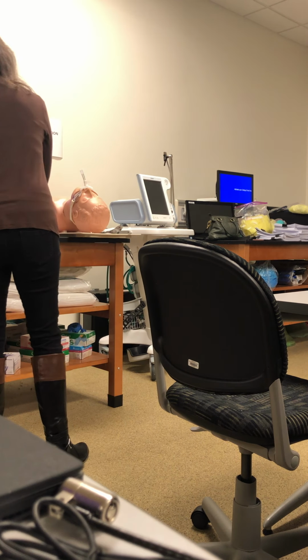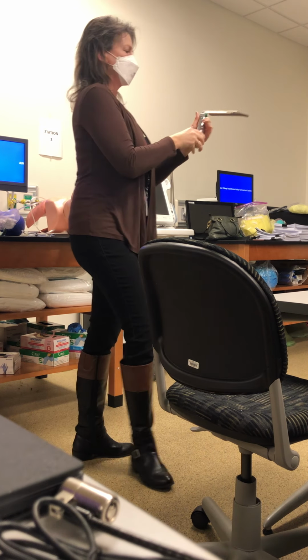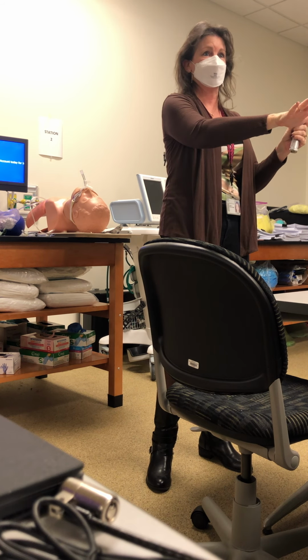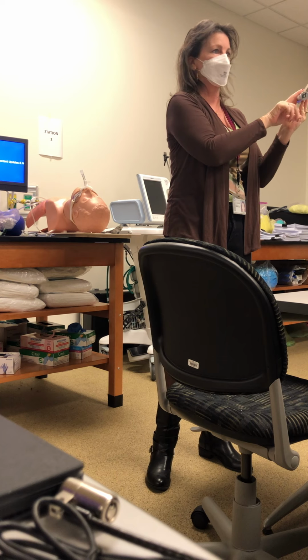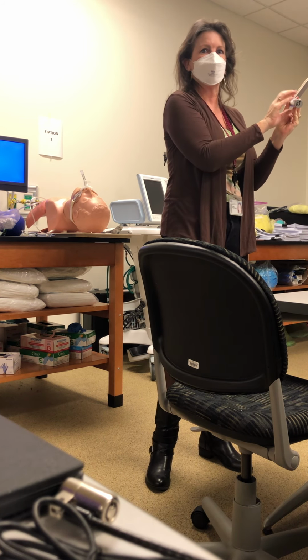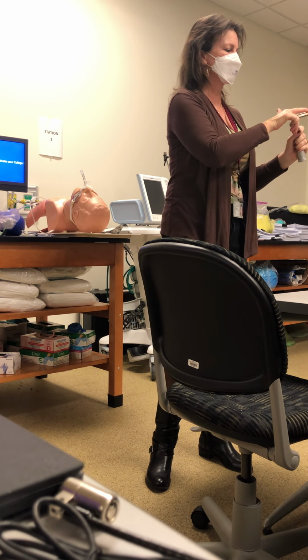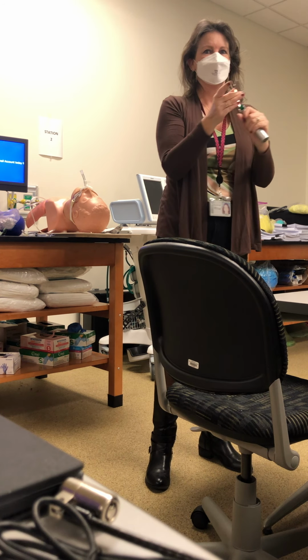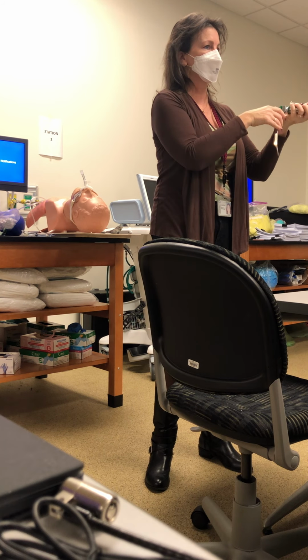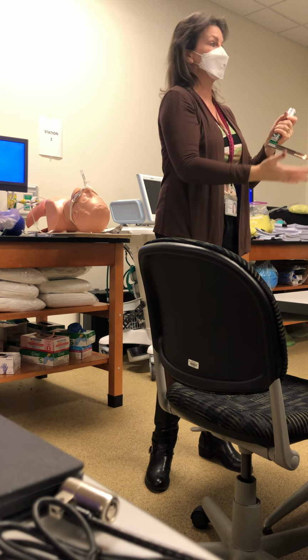Okay, the straight blade, everybody, you have to know this. You're going to see this picture, you're going to have to tell me what it is, okay? This is a laryngoscope handle. It has batteries in there, C batteries, 2 C batteries. This is the blade. This is a straight blade, and there's a light there, okay? The light is so that when they place the laryngoscope in the patient to intubate, they can have light at the end so they can see what they're doing, okay?